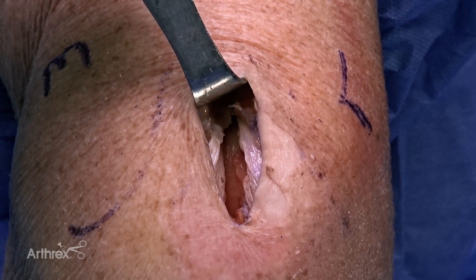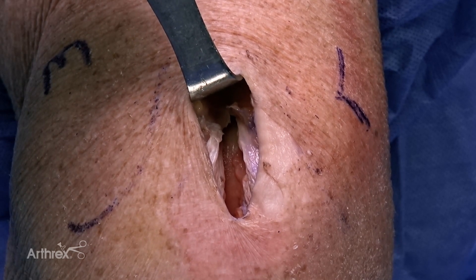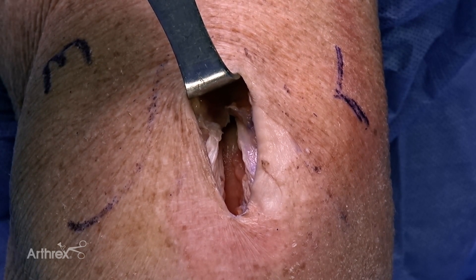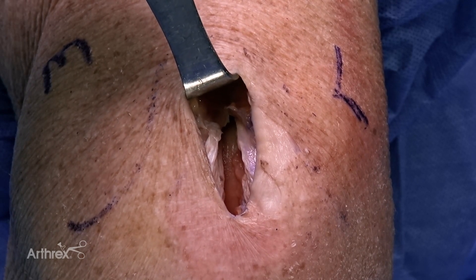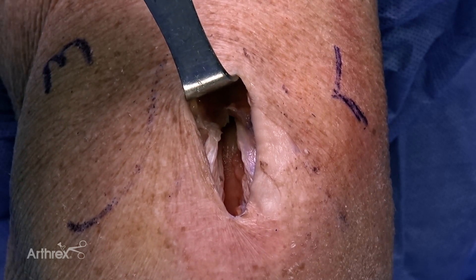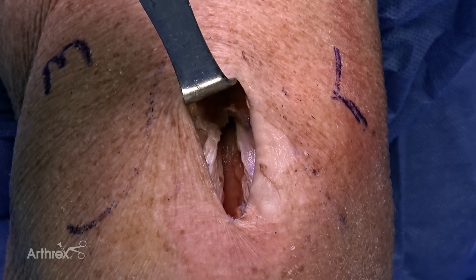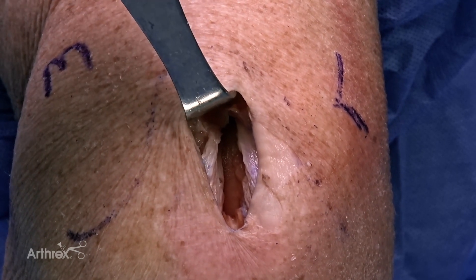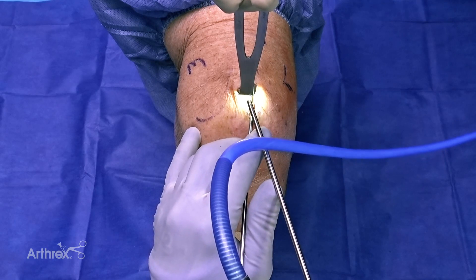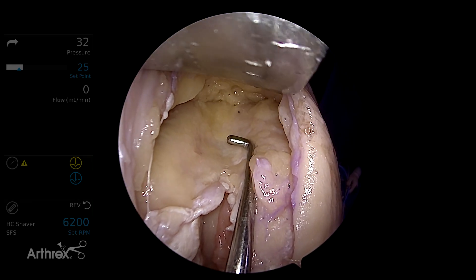I'm often asked whether the defect after quadriceps tendon harvest needs to be closed. It definitely helps with fluid management to close the defect while the graft is being prepared. If it is only a partial thickness defect without significant fluid leakage, I leave it open. However, if I harvested a full thickness quad graft, I close the defect with a running number one Vicryl suture. One advantage of the QuadPro tendon harvester is we can accurately take partial thickness grafts, minimizing breach of the suprapatellar pouch and maximizing fluid efficiency. The peritinon is left intact, protecting the remnant quadriceps tendon and facilitating tendon healing.